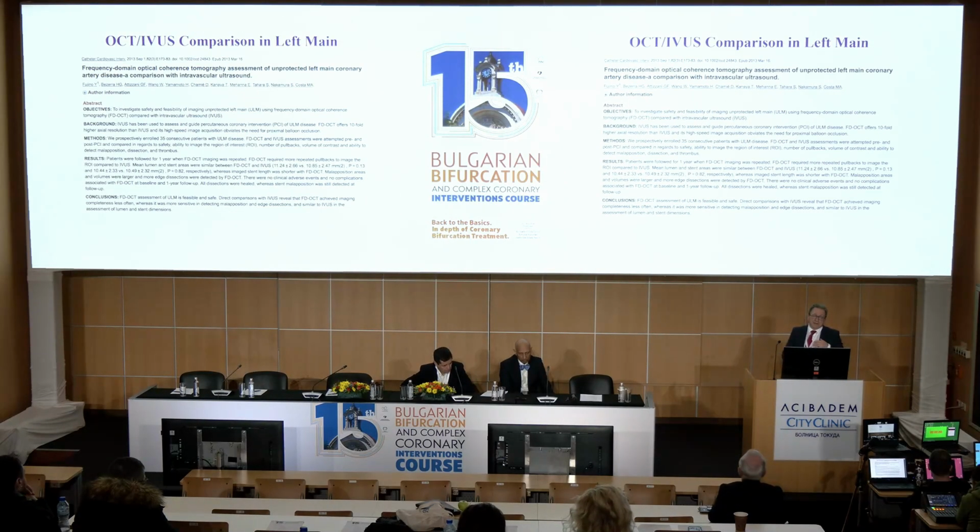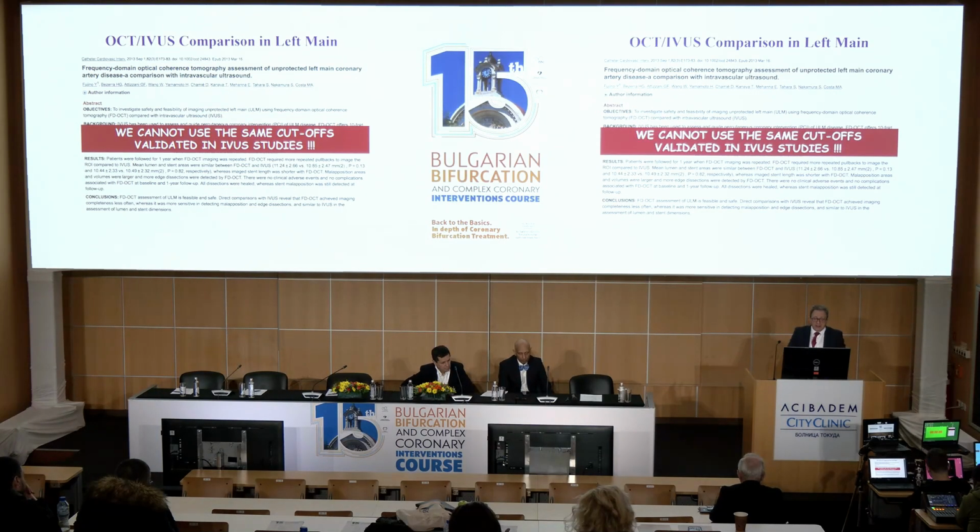And of course, there are some papers, some publications showing that in terms of comparison of these two techniques, OCT is feasible, giving very important information, and the results in general are, let's say, similar.